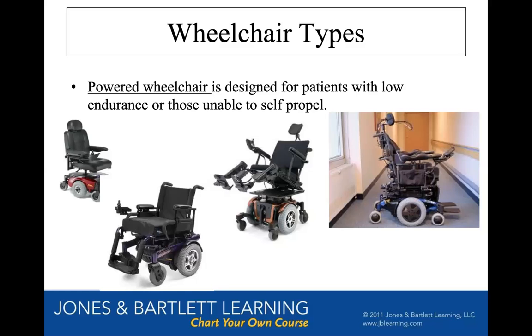But I will say that I have heard of research going into computer brain interface for wheelchair functionality. So it is coming. Now there's a lot of stuff you can do with eye movements, where your iPhone camera watches your facial movements and drives your chair. And there's Bluetooth and computer things coming out every year.